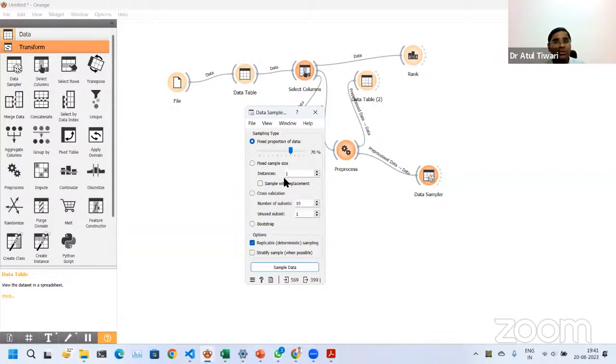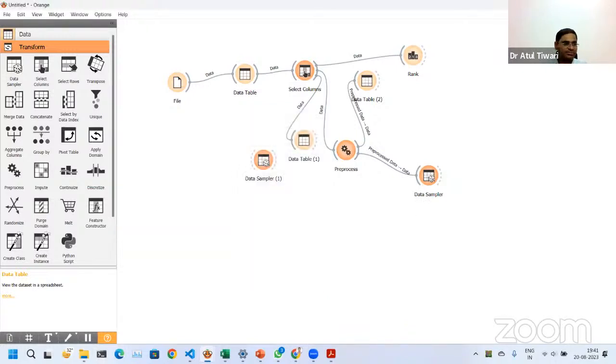If the performance is bad on the test data, then we need to somehow tweak our data set or the parameters. We need to figure out how we can modify our AI model. So for now, I am using the default setting only, that 70% of my data will be used for training.